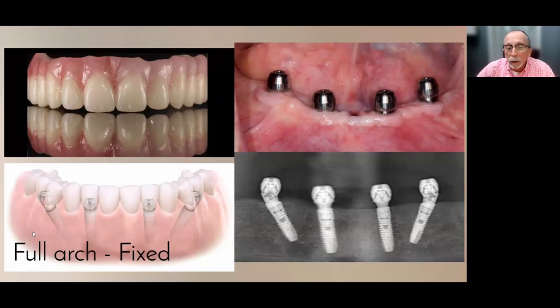But at the end of the day, whereas the locator is tissue-borne implant supported, this is fully implant-borne, implant supported. The restoration rides completely on the implants. And this is why it will feel to patients more like having real teeth again. But it's also the most expensive and the most surgery and healing and everything else. So, you make your choices.